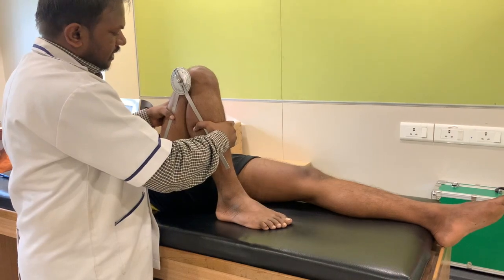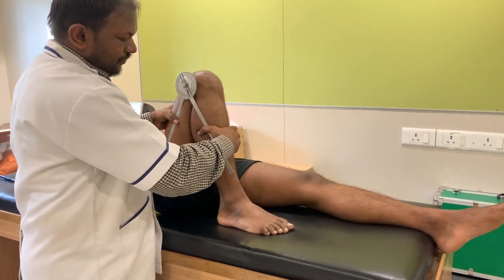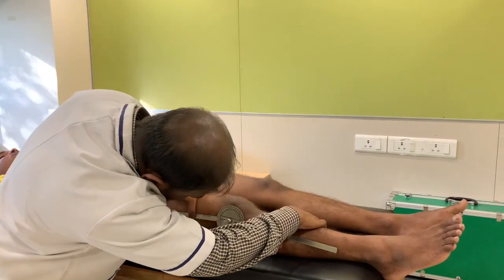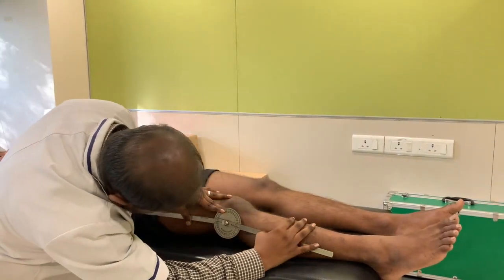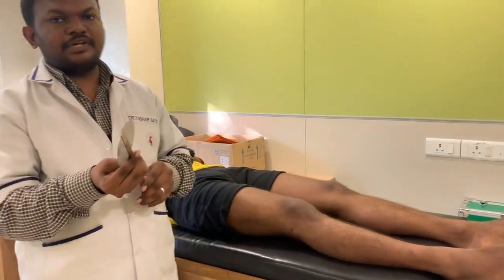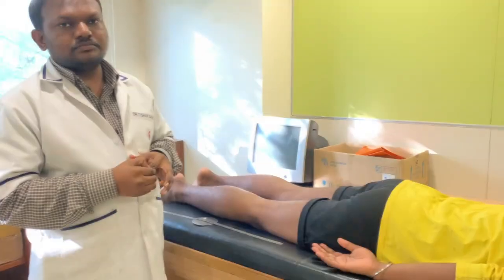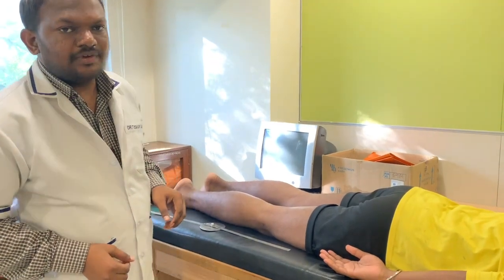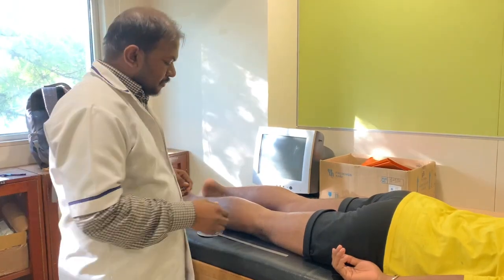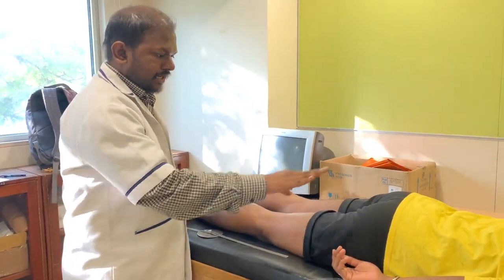So here I am getting 130 degrees of knee flexion. The initial point where it started is from 0, so it has 0 to 130 degrees of knee flexion in supine lying. Now we have seen that we can do the knee flexion in supine lying. Similarly, we can do it in prone lying.